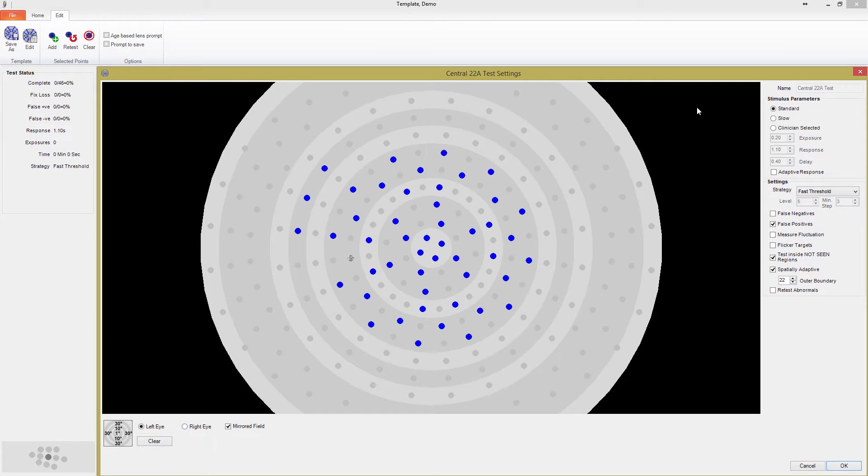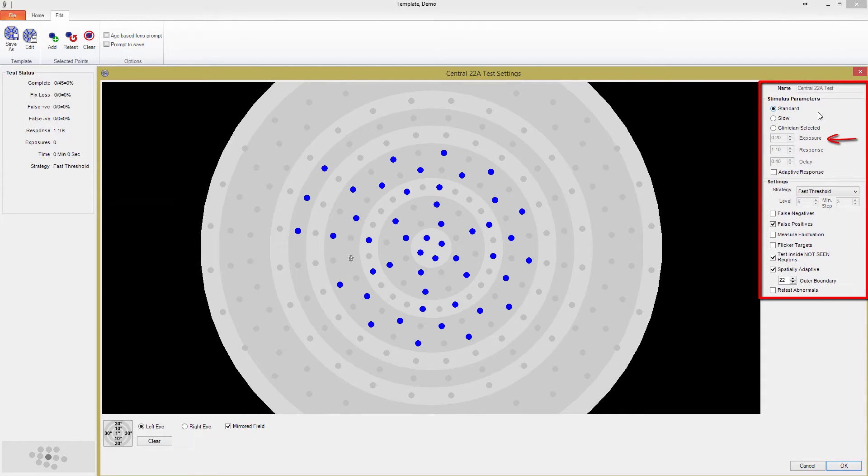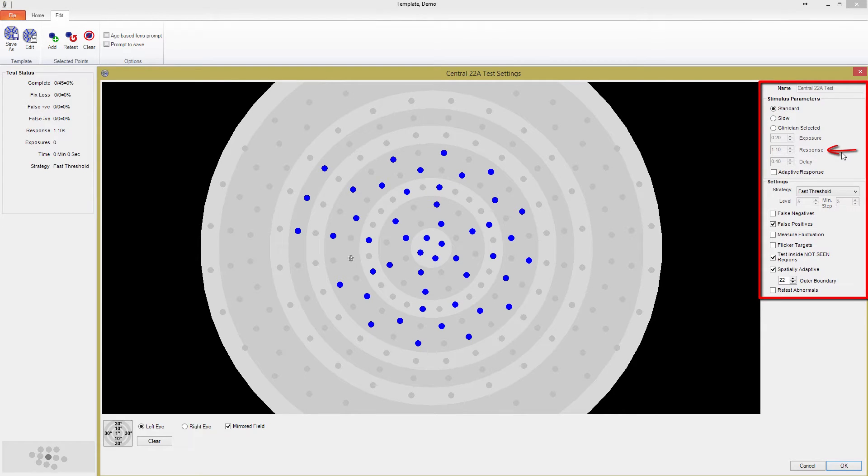Now that we've covered the basics, let's move to the stimulus parameters in the top right corner. Exposure time is the length of time the stimulus is actually illuminated for. Response determines how long the patient has to respond after the stimulus is exposed.